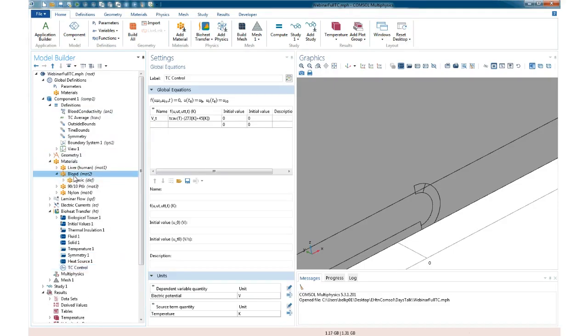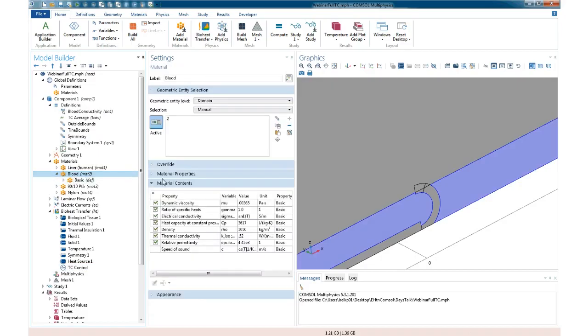Okay, well, the easiest way to do it is this: the electrical conductivity is generally a number, but COMSOL doesn't limit these sorts of parameters to being numbers. They can be functions. I didn't go over it, but this is actually an important thing to do when you're studying ablation. Here you see that when I specify the properties of blood, for example, I specify the electrical conductivity not as the default 0.734 Siemens per meter, which is what blood is, but as something I called AN1 of T.